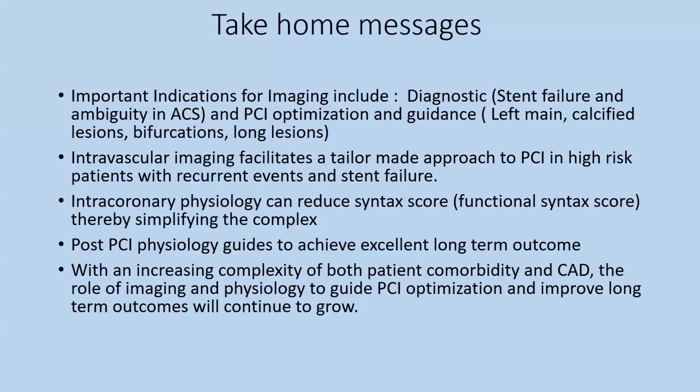So finally, to summarize, imaging is very critically useful in the cath lab, particularly in complex lesions, not only in diagnosis, but also in guidance and PCI optimization and all complex PCI, including left main calcified lesions, bifurcation PCI, long lesions, multiple lesions, as well as multi-vessel PCI, and in CTOs.